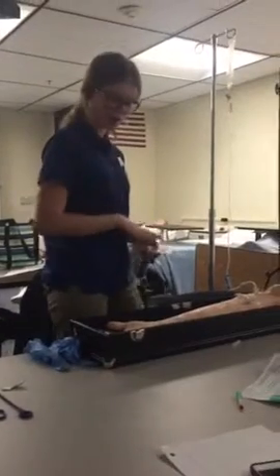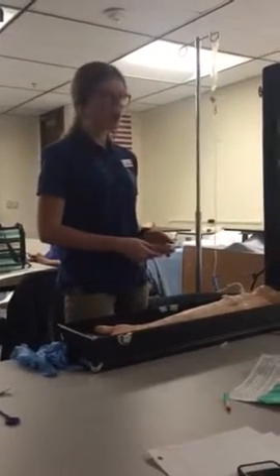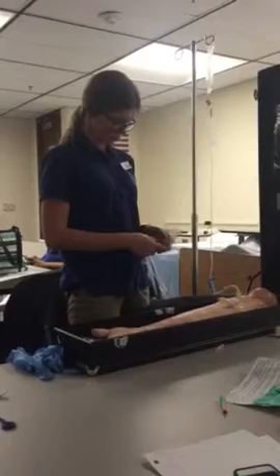So now that you've done this, you can go in your client's room. Hi, Mr. Johnson. My name's Kalie. I'm going to be your nurse today. The doctor has ordered some more medication for you to go through your IV.